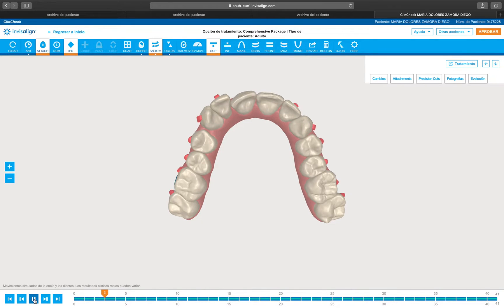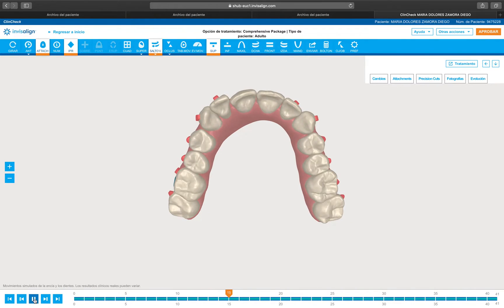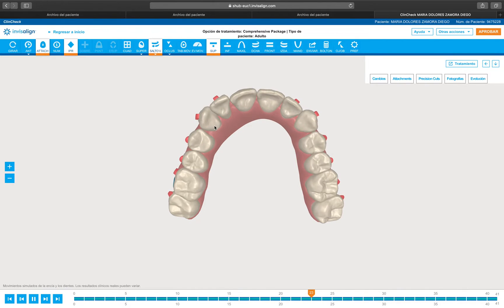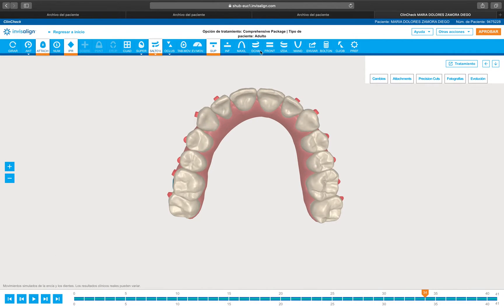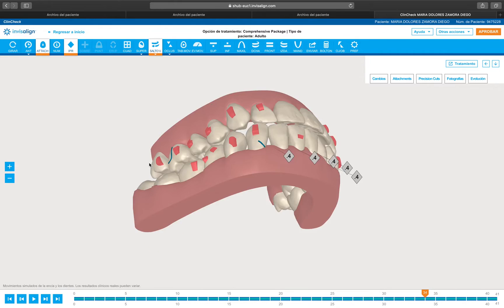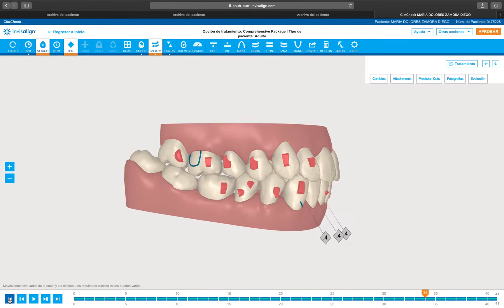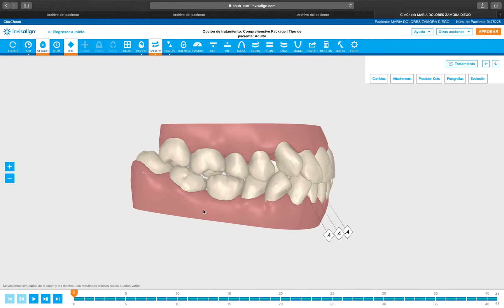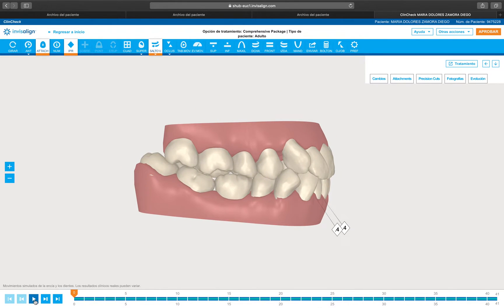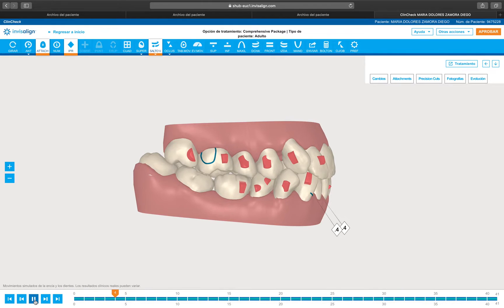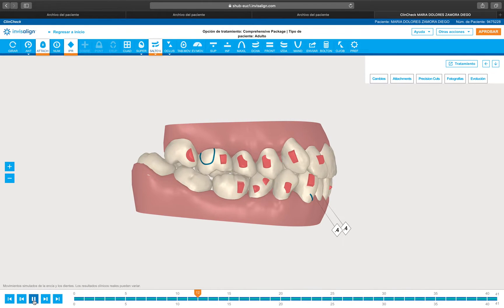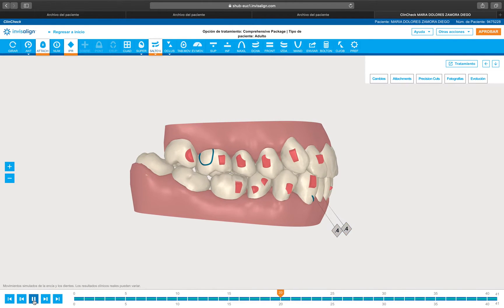Look at the way I'm doing this. I'm expanding distal out — distal out, distal out. As you can see here I'm rotating distal out, but I'm not modifying the tipping.